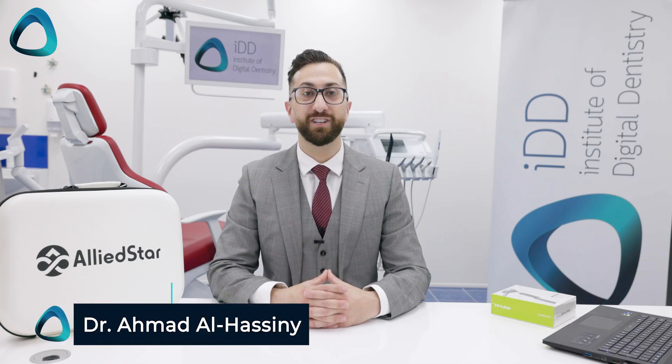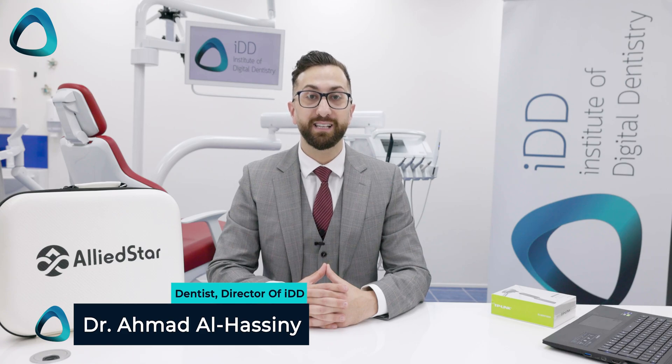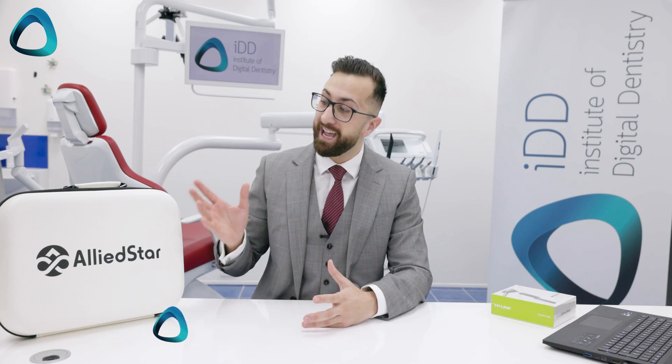Dr. Ahmed Al-Hasni here from the Institute of Digital Dentistry, and in this video I will show you what you get with Alliedstar's newest scanner, the AS200E.